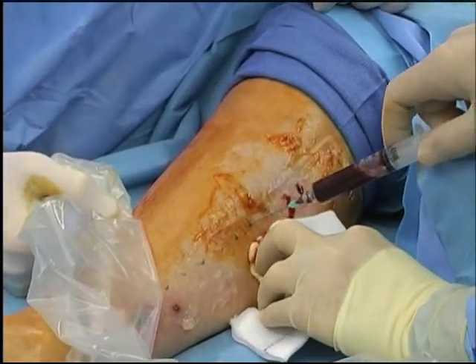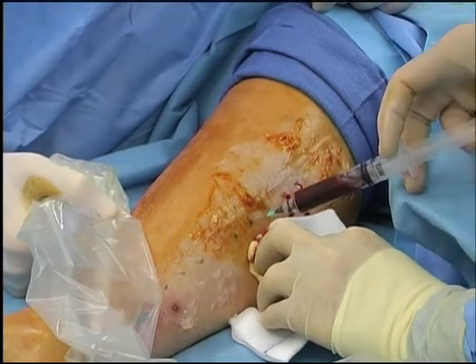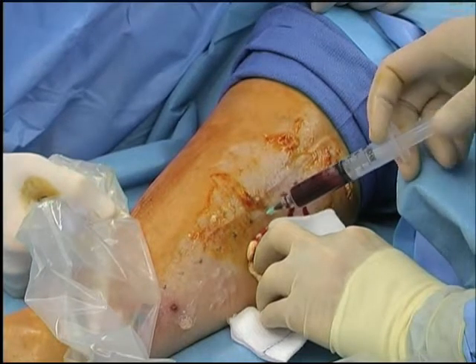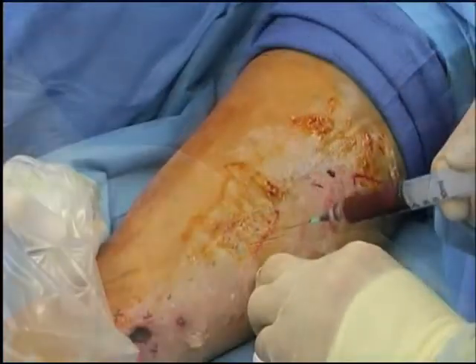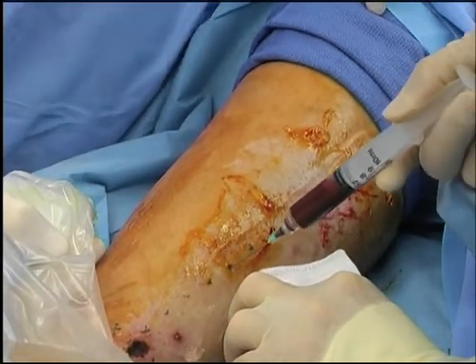Although the target areas will typically have occluded arteries, the ultrasound may identify the popliteal or tibial veins, which are always adjacent to the native arteries. To minimize the risk of nerve injury, the injection is placed approximately 5 to 10 millimeters away from the neurovascular bundle.